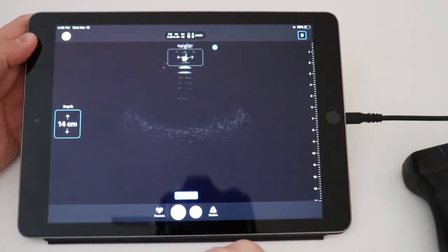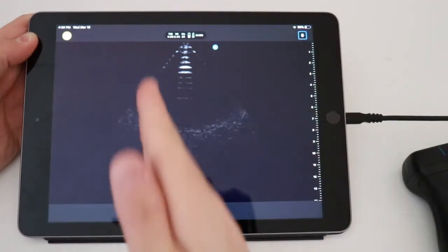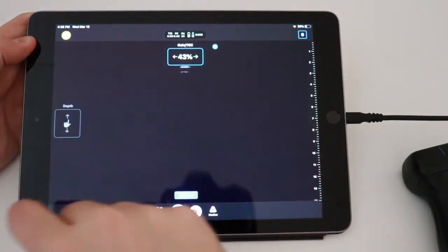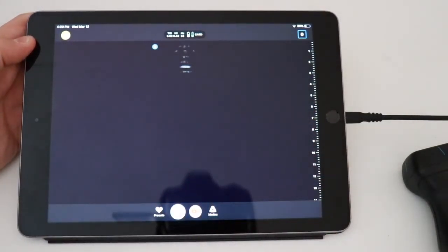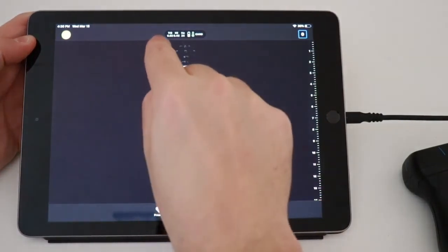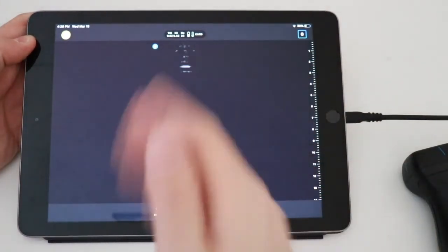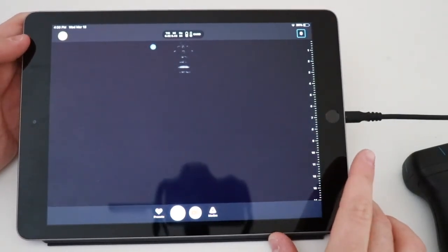We talked about before, this indicator is on the right in standard cardiac format. It's over on the left in the EM and radiology format. And we've been using the radiology and EM format for the sake of consistency. To move this over, all I have to do is tap that at the top, and it'll move it from the left to the right or vice versa. So if I tap again, it'll move to the right. If I tap that way, it'll move to the left. So again, the left is what we're going to be using for all of our exams.